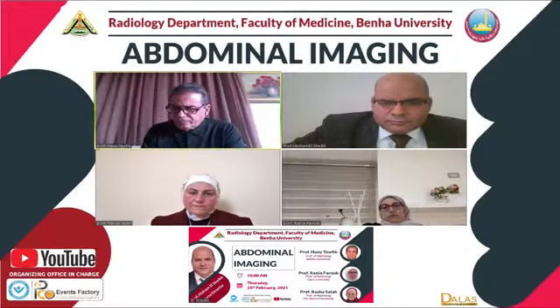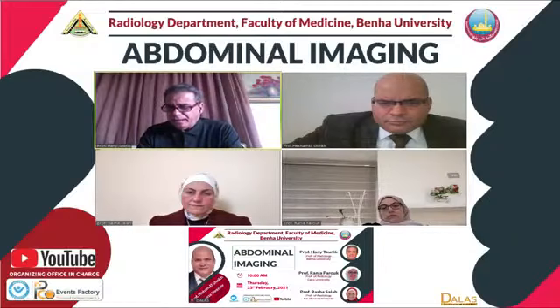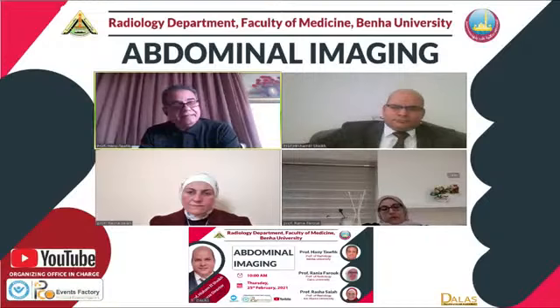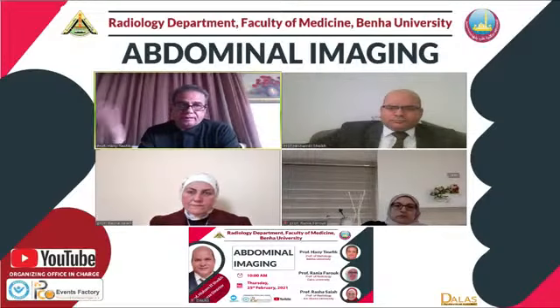أنا ليا بس تعليق وسؤال. التعليق بالنسبة للـ ultra low rectal cancer، فطبعا حضرتك غطيتيه تماما، إنما هو في تقسيمة جراحية يعملها Rullier الفرنساوي اللي هو الـ suprasphincteric والـ juxtasphincteric والـ intersphincteric والـ transsphincteric. فدي برضو لو دكتور الأشعة بيبقى oriented بيها هيساعد في الـ staging، يعني يذكرها في التقرير بتاعه. إن هي الـ suprasphincteric في الـ ultra low يعني أكتر من 1 سم من السفنكتر من الـ anorectal ring، عشان دي خلاص بتتعامل total mesorectal excision زي باقي الـ cancer rectum.